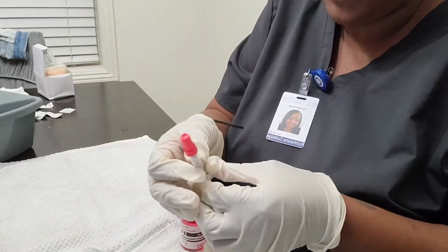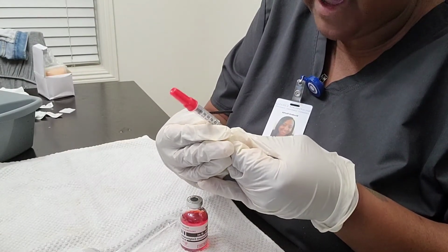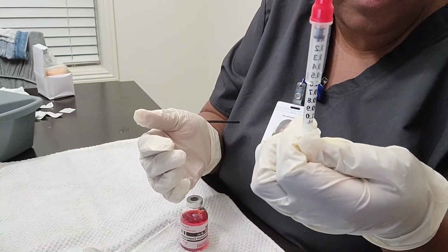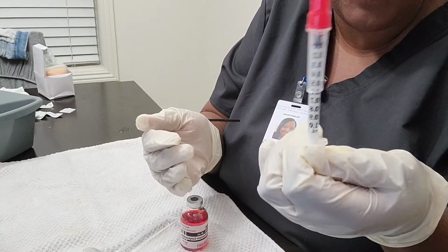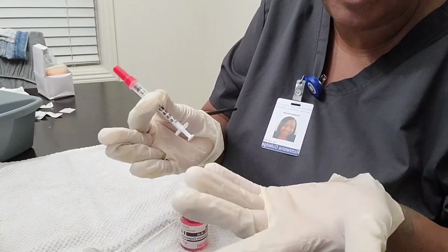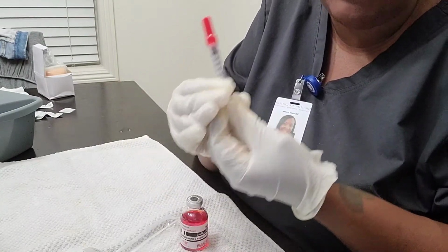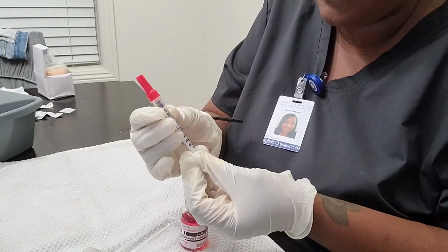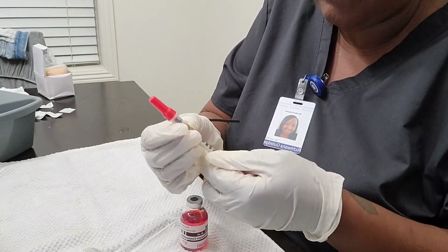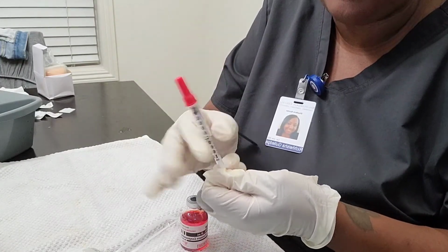Okay, and so I do want to note that I don't have a 1.5 syringe. This is a 1.0 milliliters. So this is all I have. This is all that was sent to me in my kit. So I just have to use what I have. So I don't have a 1.5, but I will just act like this is a 1.5. So I just want to note that.